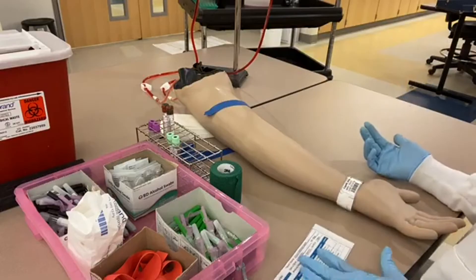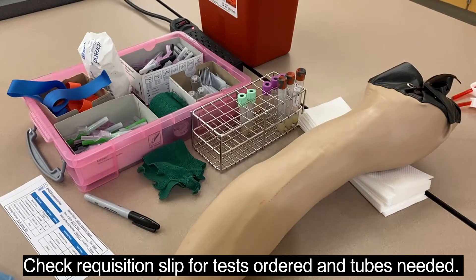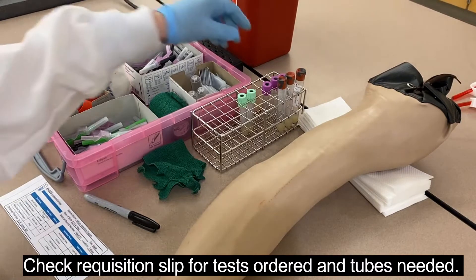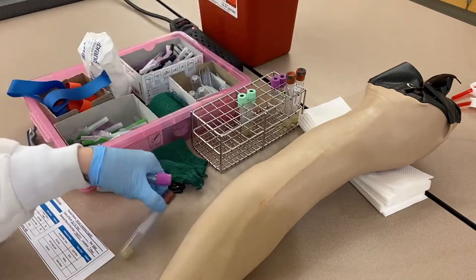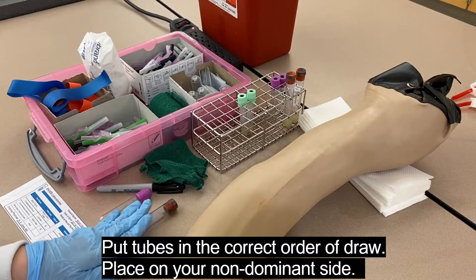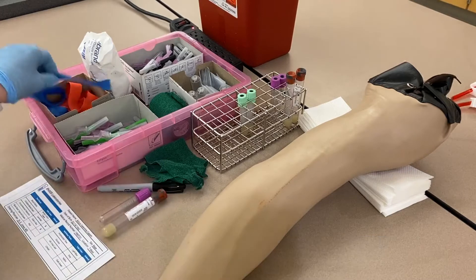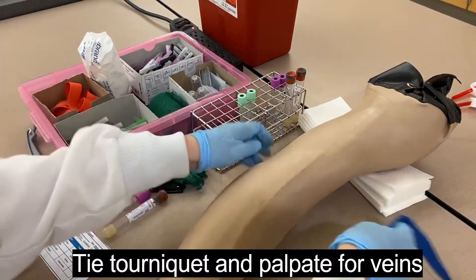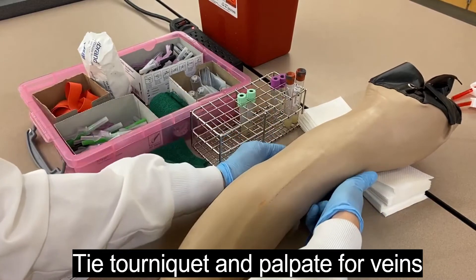I'm going to check what blood tests have been ordered. We have a complete blood count in the lavender tube and a comprehensive chemistry in a gold, red, or tiger top. I'll get my lavender and my tiger top and put them in the correct order — serum is drawn before lavender — so tiger top first, lavender second. Then I will assess the patient's vein situation because not every patient has beautiful veins.